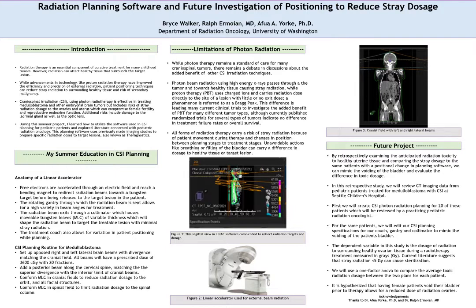Currently, photon radiation that we've been talking about here remains the standard of care. Randomized control trials show no differences in treatment between proton and photon radiation as far as overall survival or treatment failure rates. Additionally, proton radiation requires much larger particle accelerators, can take a good chunk of a building, and it's financially unfeasible for a lot of hospitals.